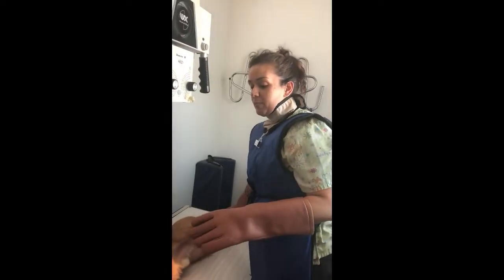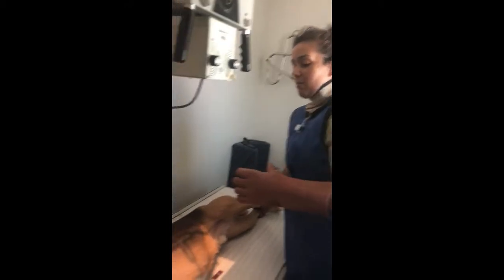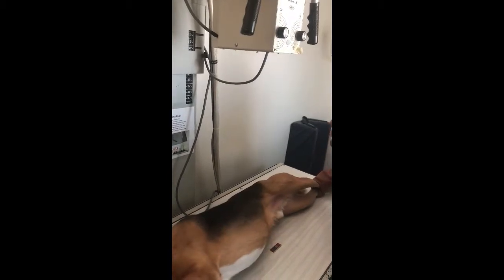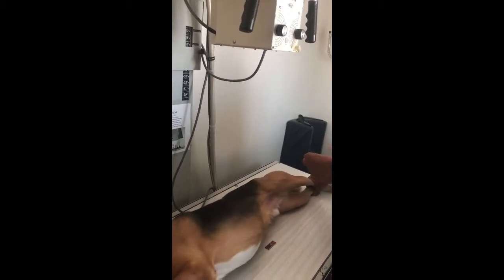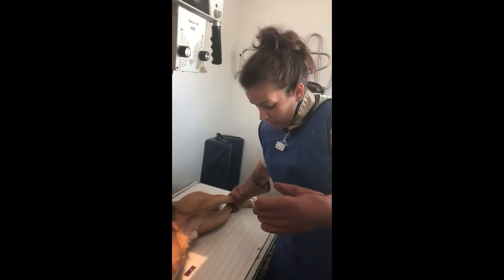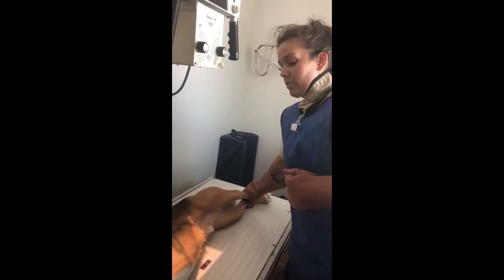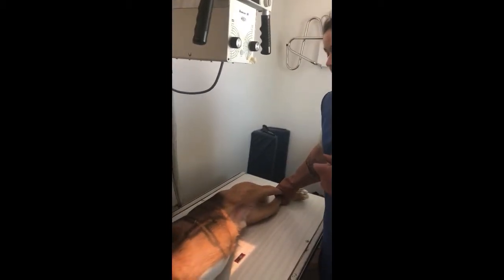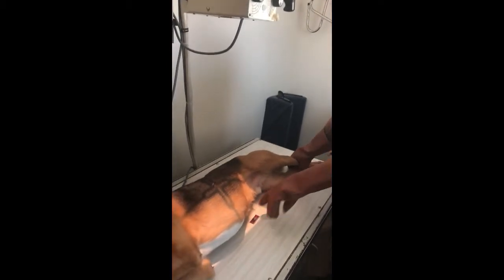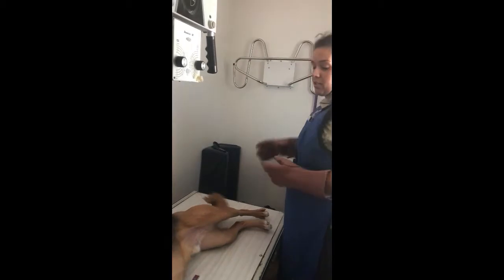Okay, so he's had his barium. It's been about 10 minutes. So we're going to take our first shot to see where it's at. And then if we see anything suspect, then we'll continue to take the same shot roughly every 10 minutes until we've reached a conclusion as to whether he has an obstruction or not. So we get our initial. We have our marker and our good boy. Then we turn it off.